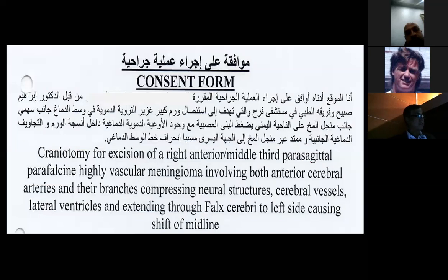Craniotomy for excision of a right anterior middle third parasagittal parafalcine, highly vascular meningioma, involving both anterior cerebral arteries and their branches, compressing the neural structures, cerebral vessels, and lateral ventricles, and extending through the falx from the right to the left side.